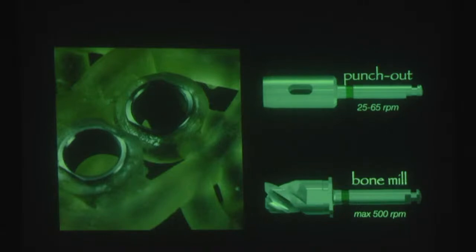We have to flatten the surface. And after it, we will place the implant. So think of the extraction sockets just like an ice cream cone, okay? And when you place the drill, the shoulders of the drill tube will touch the inner parts of the extraction socket. So it is very important for us to make the implant placement surface flat.